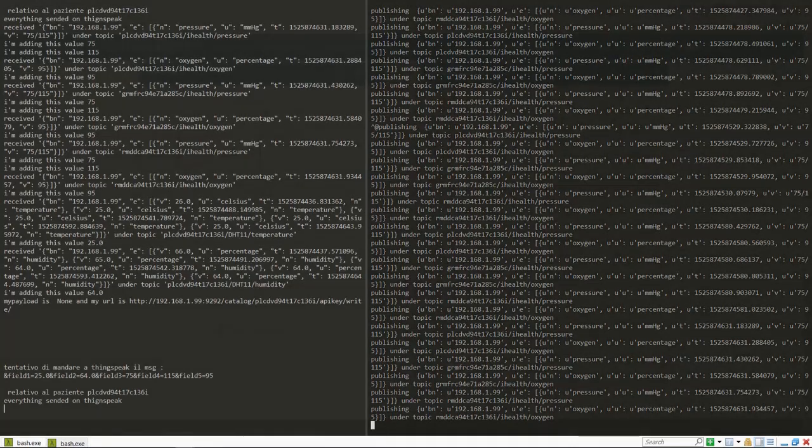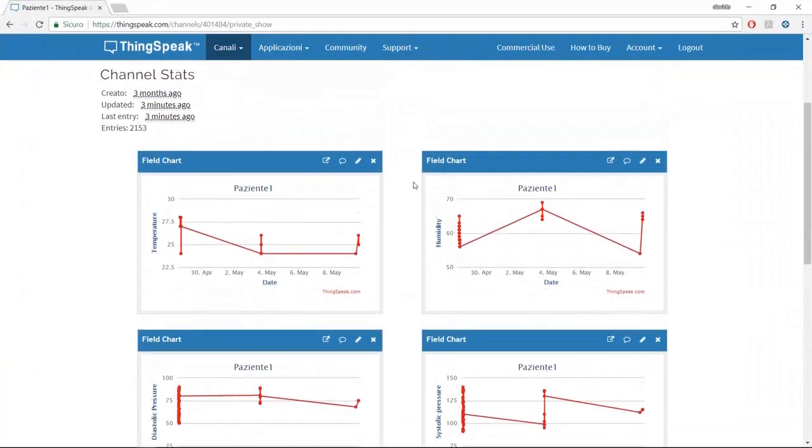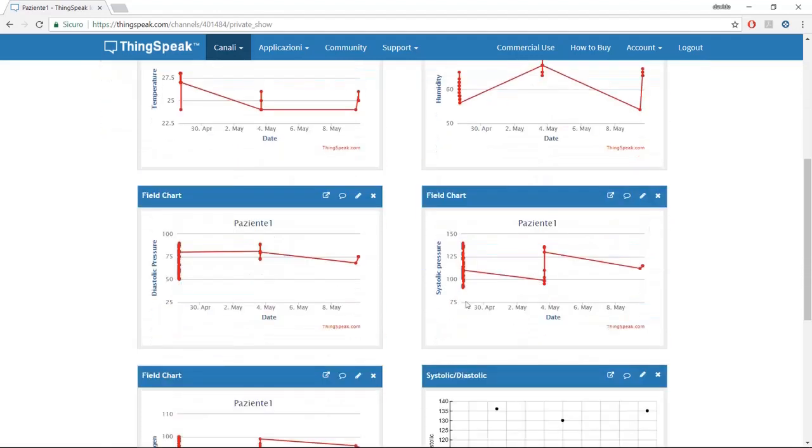For example, field 1 is 25, field 2 is 64, field 3 is 75. Let's see on the ThingSpeak platform. The last value is 25 for the first field, 64 for the second field, and 75 for the third field.